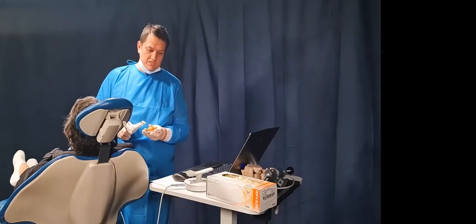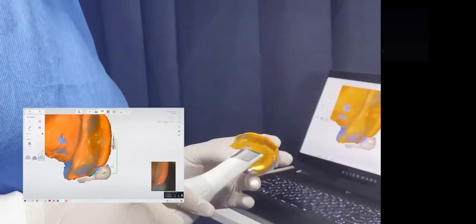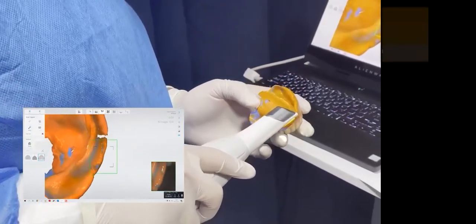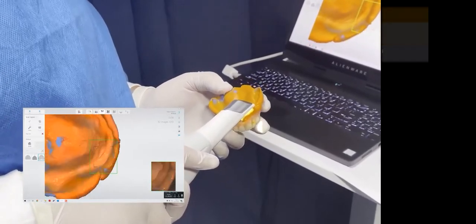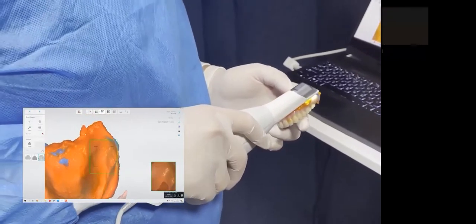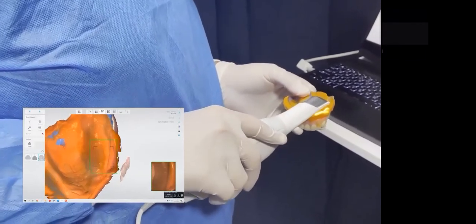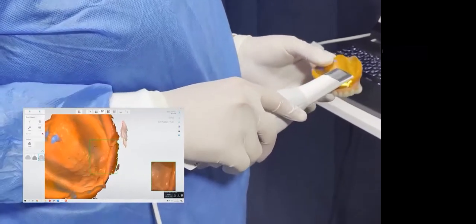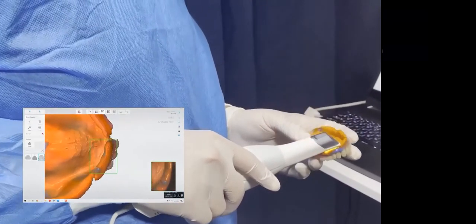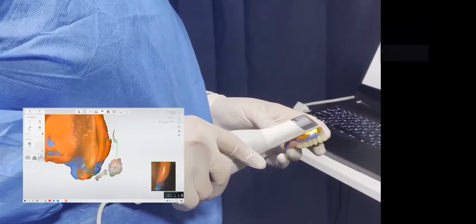So what you want to do is you want to be very careful how you get to the buccal. It's happened to me so many times. When you roll, you want to go around first and capture all the sulcus, and you roll just like that rock and roll move I taught you for incisal edges. You want to treat the sulcus of this denture as an incisal edge as you slowly roll over. Now as you do that, I hope you can see this well, you'll be able to roll to the buccal. So again, rolling, rolling, rolling, and these are the things that you may not have thought of, but it's very important.